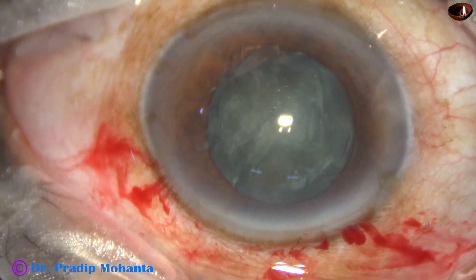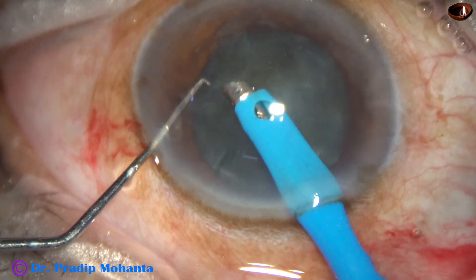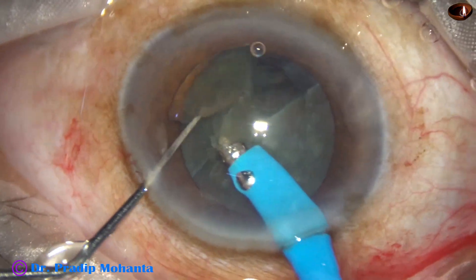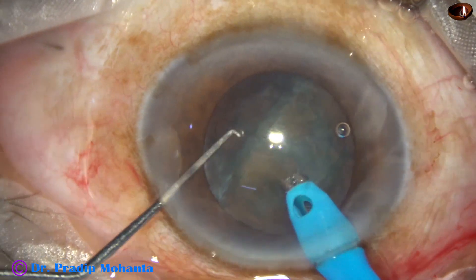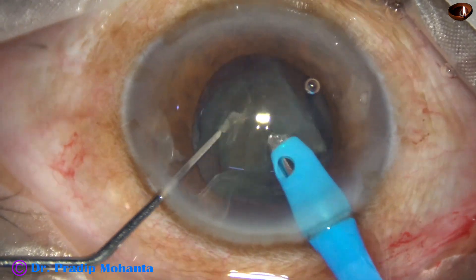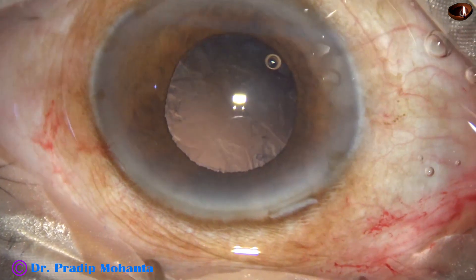The anterior chamber is again filled up with viscoelastic, and now it is easy to pick up the pieces and emulsify them. The flow rate is 45 ml per minute and vacuum is 450 millimeters of mercury. Nucleus management is done.